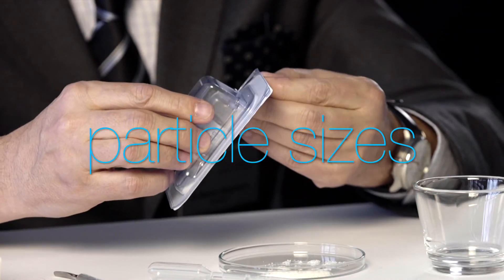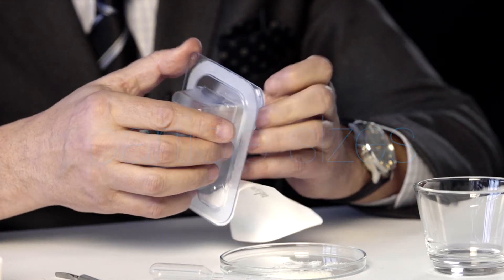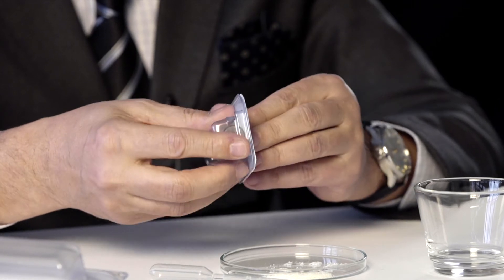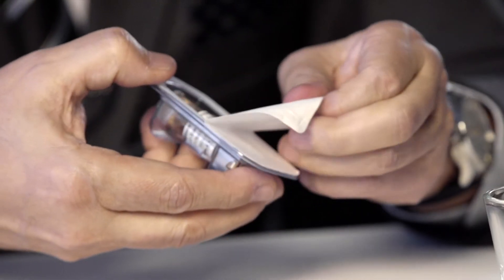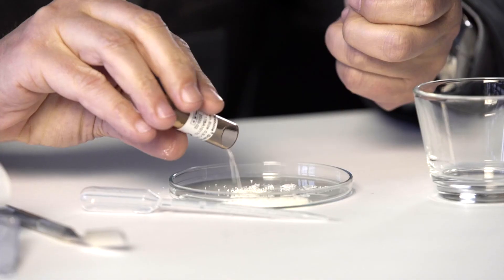Serabone comes in two particle sizes. We prefer the 0.5 to 1 mm size for GBR. The bigger particle size, if we want to use it, we do it only in big augmentation or sinus augmentation.